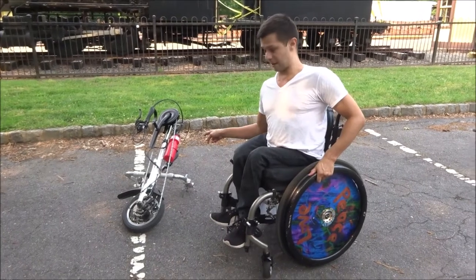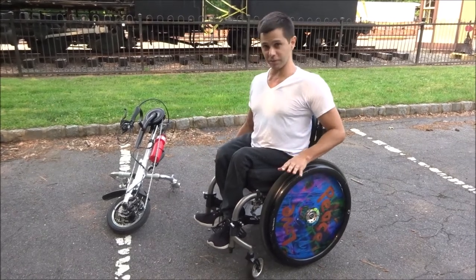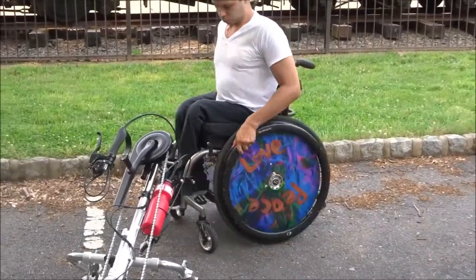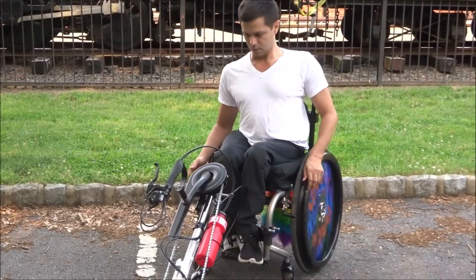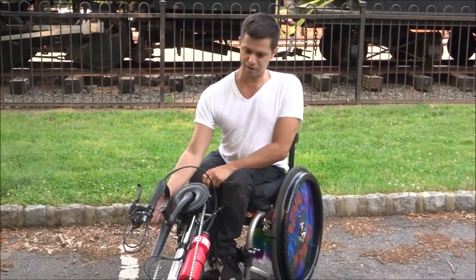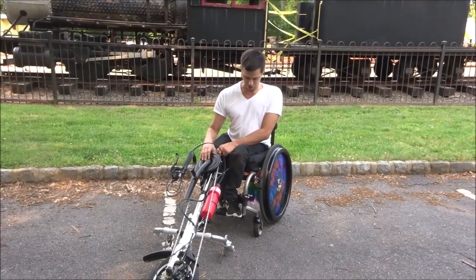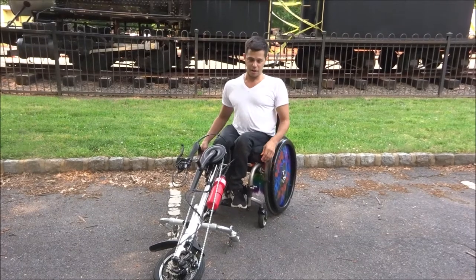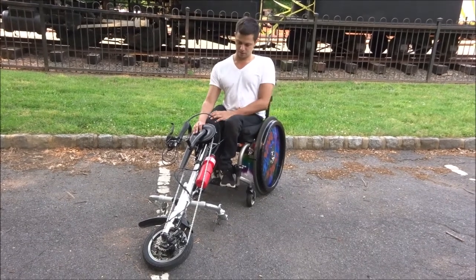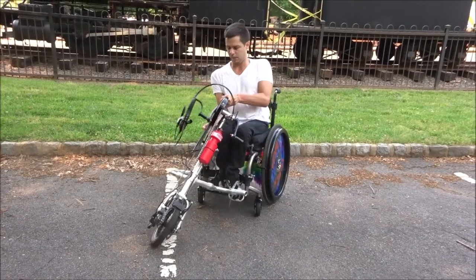I'm going to attempt to put it back on. This is far more difficult than even taking it off, so we'll see if I can do it. It's kind of tricky for a variety of reasons — as I mentioned in the other video, this is kind of heavy and clumsy. But another reason is that you can't have your brakes on when you do it, because if you do, the attachment won't go in far enough. So it's really difficult, but anyway, we'll see if I can do it.